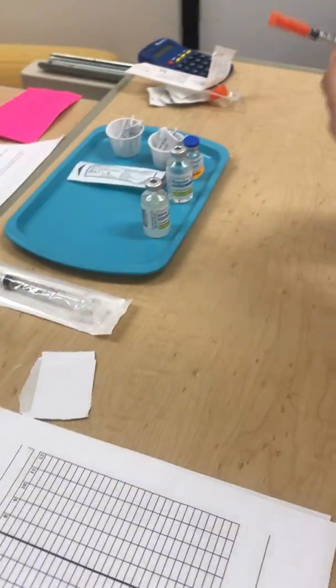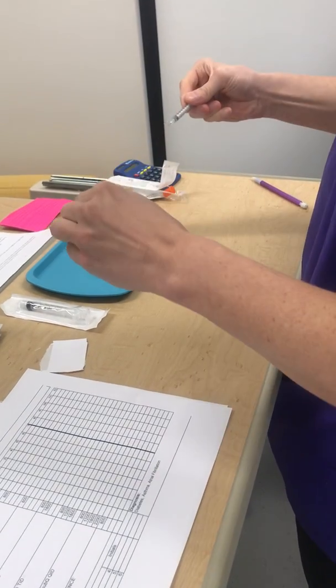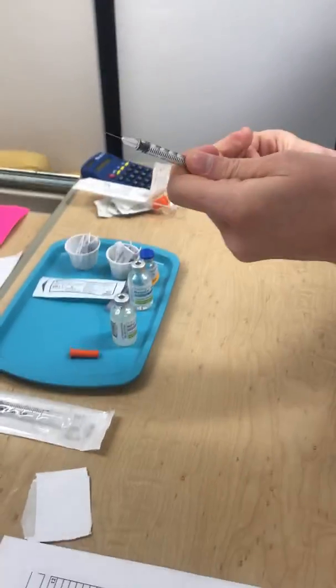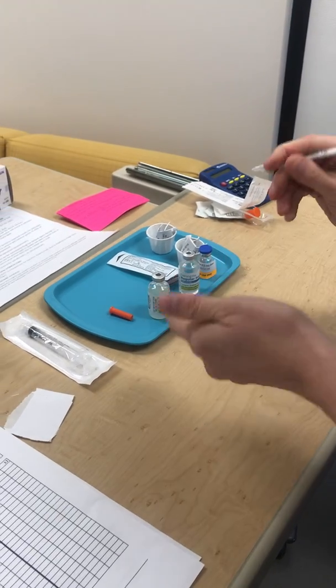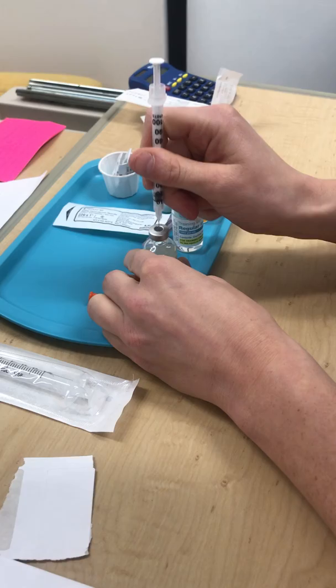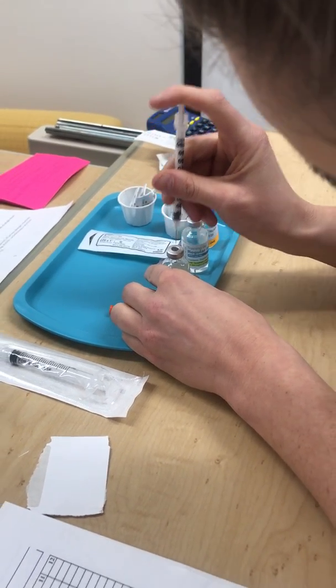So yep, I'm going to pull this cap straight off. Right there. And then I'm going to just loosen this, and then 10 units. Yep, I checked that this is 10, so I'm just going to insert 10 units of air into this one, and I'm not going to touch any of the liquid. Perfect. Pull straight out.